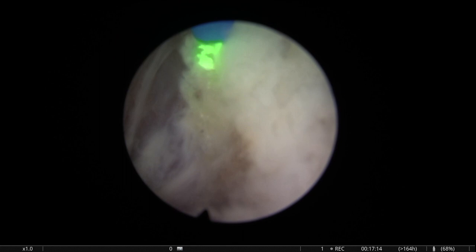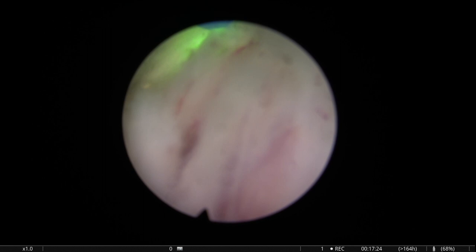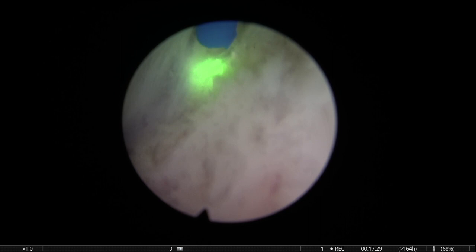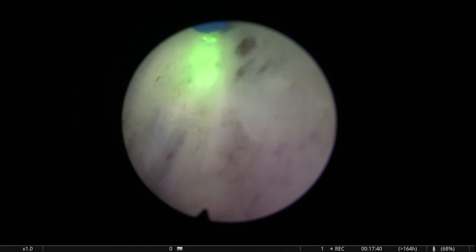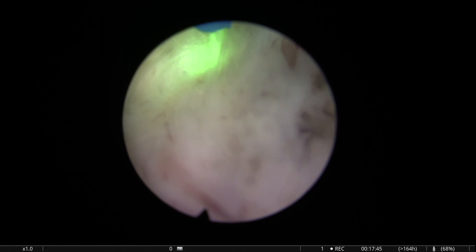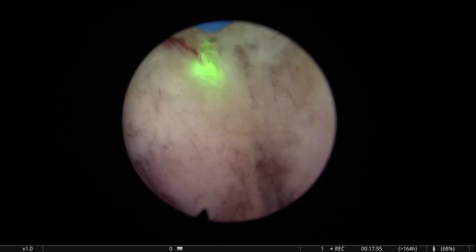Is this tissue looking good? Should I go deeper? You know, sometimes it gets you into a little bit of trouble. For example, that plane there looked a little bit deep. So I'm just guessing, I'm just finding out where the plane is going in this case. So that's the idea, correcting, checking the tissue. If that area looked a little bit deep, I'm going to tilt the fiber a little bit closer to the adenoma, so my dissection is not going to follow the path to the deeper areas, but just stay in the interface between adenoma and capsule.